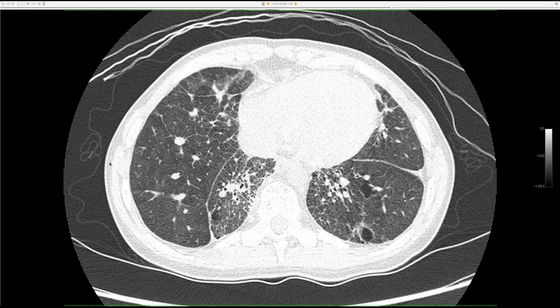And how to put it all together. This was her last CT that I was asked to look at. It's from 2016, so hard to know what's going on now. But I think we scanned her this week, and so she has a slowly progressive.